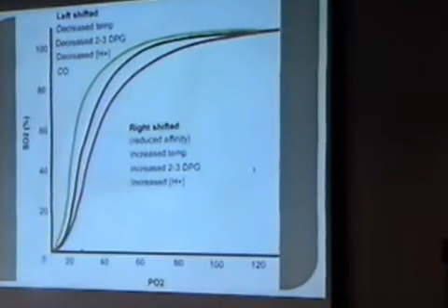Now, if you go downstairs to the premature baby and you do arterial blood gas, you get saturation in the arterial blood gas. Which saturation will be higher? The one in the arterial blood gas or the one in the pulse oximeter? Those who are doing arterial blood gas, what do you notice? Which one has higher saturation? The saturation monitor or the one in the arterial blood gas? This should be the same. For you, it should be the same.